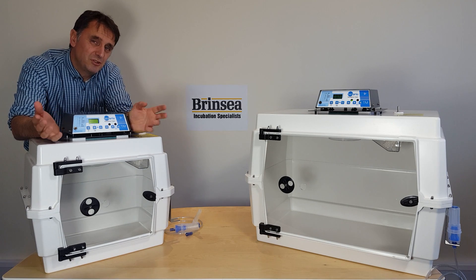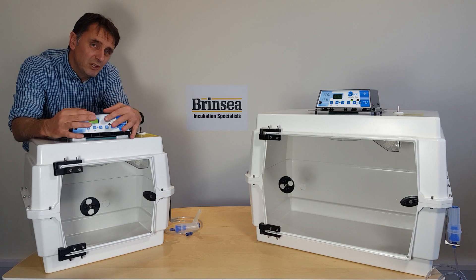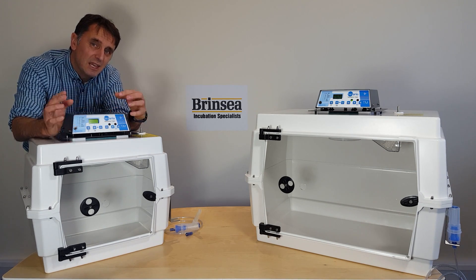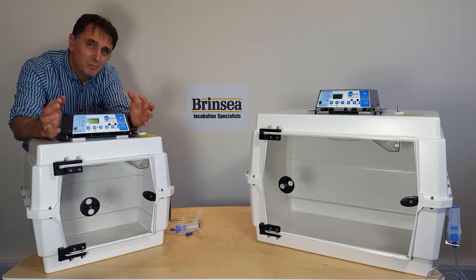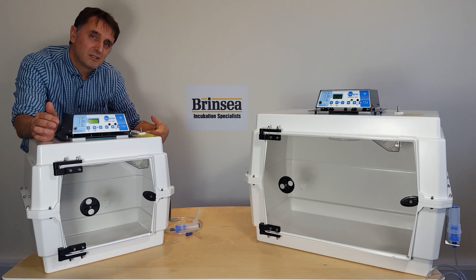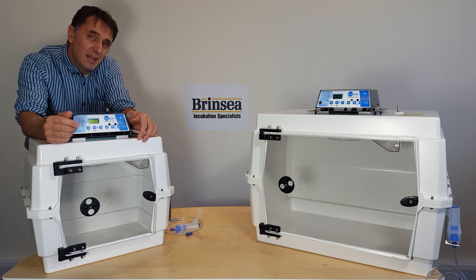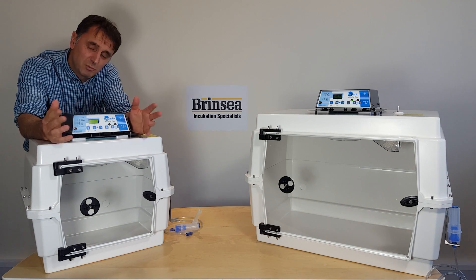It comes, as you can see, in two sizes. The smaller unit is what we call the T40M. It has an effective 40-litre volume with a floor area of 40 centimetres wide, 30 centimetres deep, and 48 centimetres high. That makes it suitable for rodents, kittens, and small puppies.